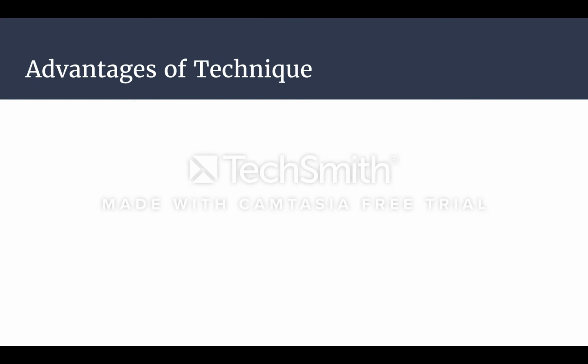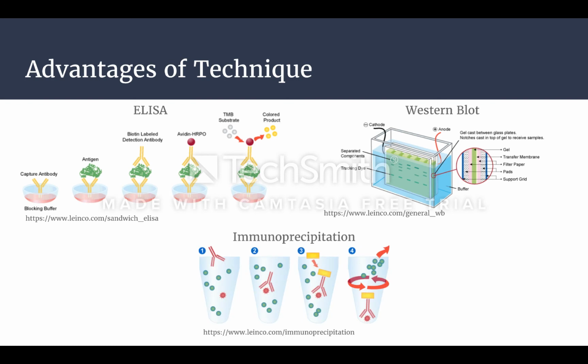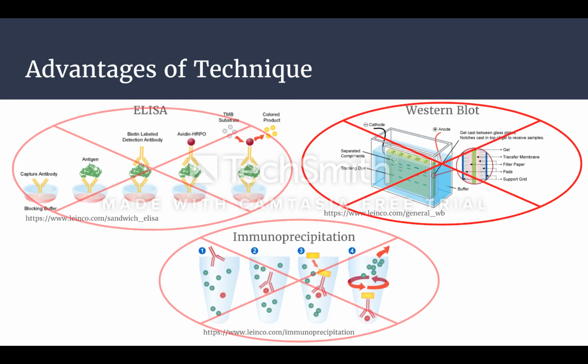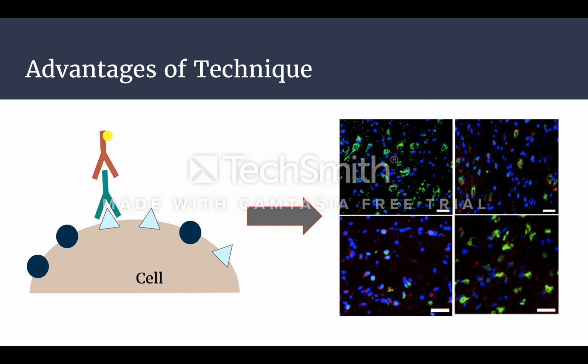Other common methods used for protein detection include ELISA, Western blotting, and immunoprecipitation. While these techniques are valid to use for protein detection, IHC poses advantages over them for the following reasons. IHC involves specific antigen to antibody reactions. This is advantageous over traditional special enzyme staining techniques because it can be used to identify numerous proteins, enzymes, and tissue structures, as well as spatial location. Also, detection rates with immunofluorescence histochemistry have higher detection rates and higher sensitivity in results, providing better images for diagnosis.